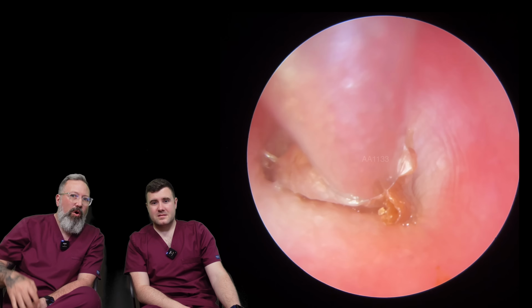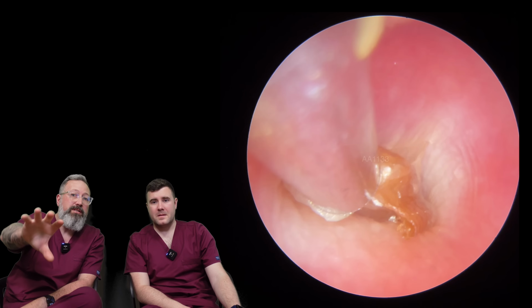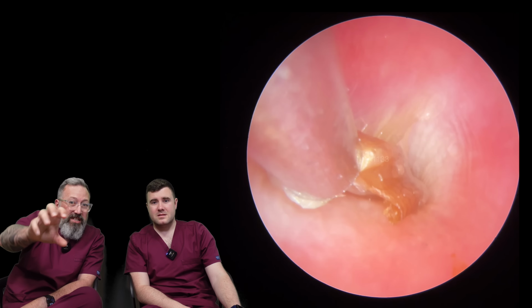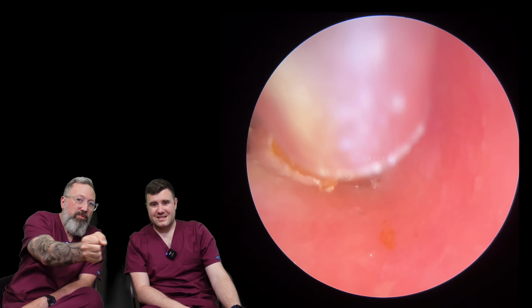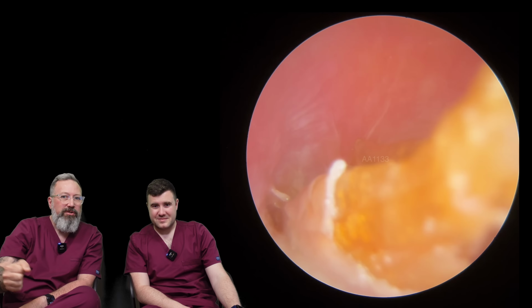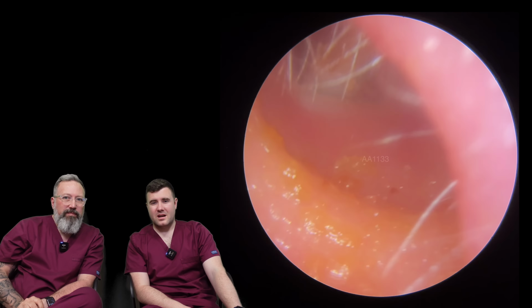And you can see we're holding on. I'm not even too sure whether it's me or you doing this, but we're really gripping it with the suction, holding it in place, letting the suction power build, and then doing this left and right motion to try and detach it as much as we can. Are the forceps going in? I was just about to say that the forceps are going to make an appearance. We're going to have a go at the forceps.